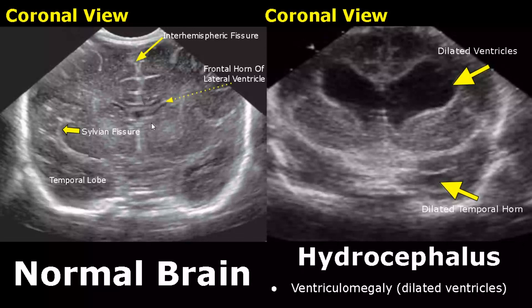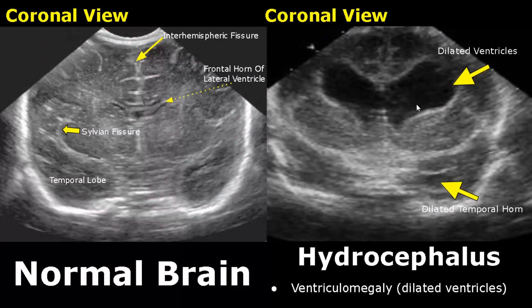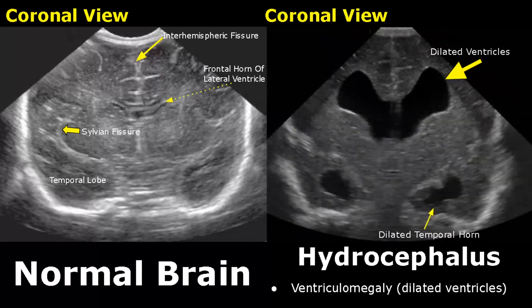Now we move on to pathologies. The first case is hydrocephalus. There is abnormal accumulation of CSF within the lateral ventricles, leading to dilated ventricles. The temporal horn is also dilated. Here is another case of hydrocephalus — we see dilated ventricles with temporal horns also dilated.